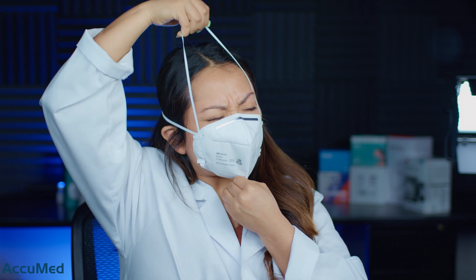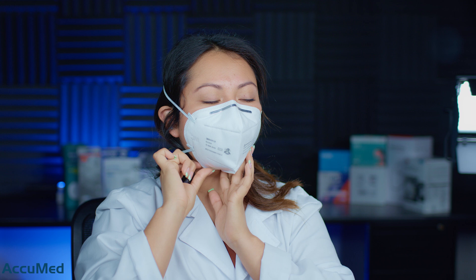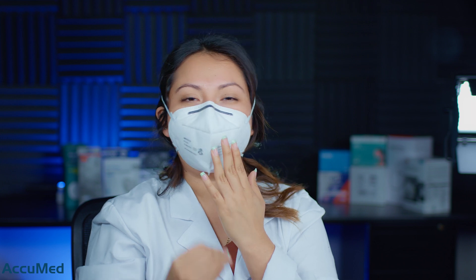Let's go ahead and try it on and see how it fits. That one's a tight one. I do definitely feel like I am getting a very good seal. It has a very strong smell — a very plastic, latex smell, but it also feels like it has a cover-up scent.